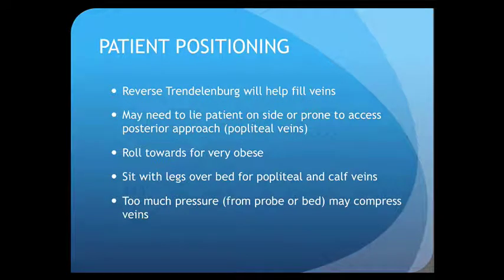In general, I will always try and get the veins to be as full as possible to do this exam because it makes them easier to see. And so I tilt the bed, and I'll tilt that up to 20 or 30 degrees to try and get the veins as full as possible.